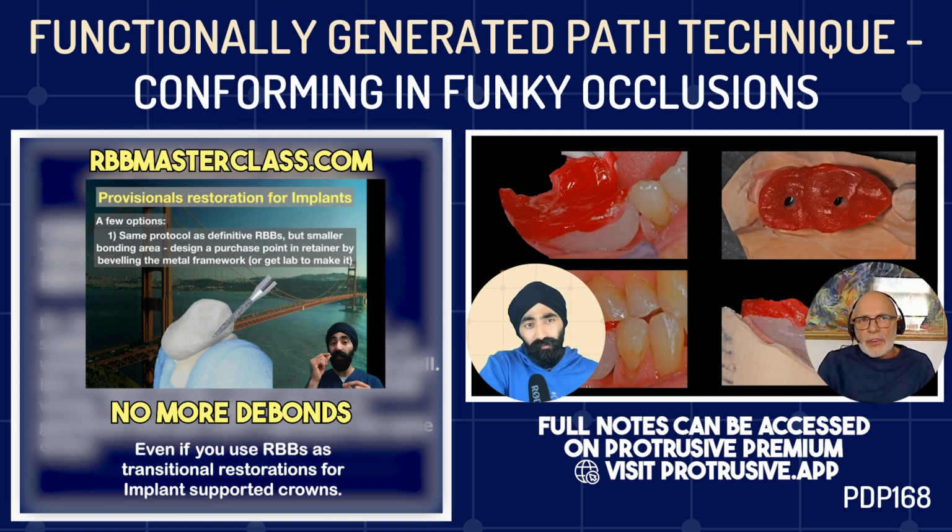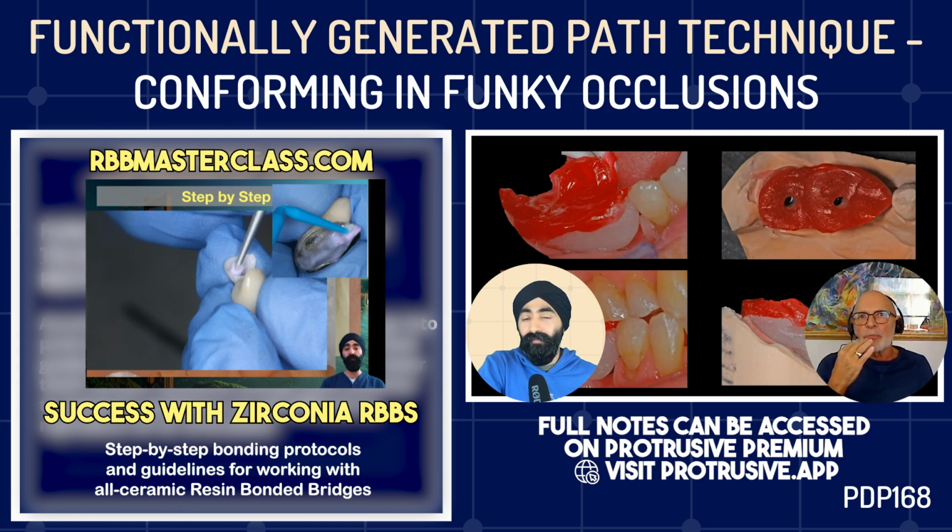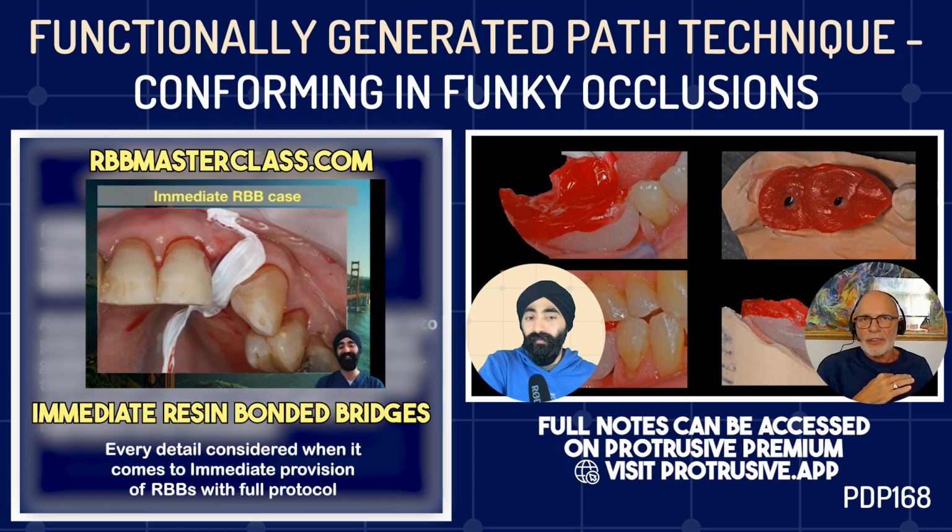I think it is in those funny cases we discussed with the Class III and the anterior open bite, the third one, the one that I forgot to mention this. I don't know how many of you realize that patients can go into protrusive, where they go into initial incisal guidance, but they can then bring their lower teeth further forwards, and they go from anterior to posterior guidance. Again, terribly difficult to reproduce on an articulator. So I think it's where you just have difficult occlusions, or you're not really sure.